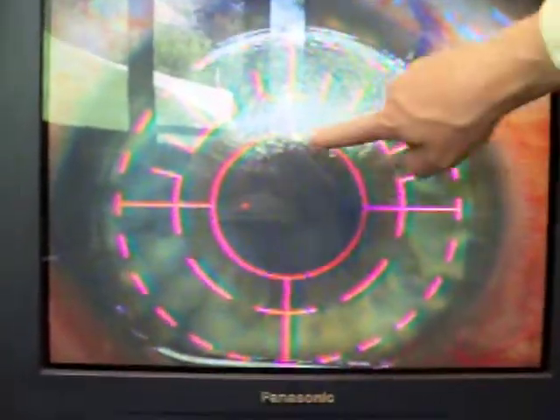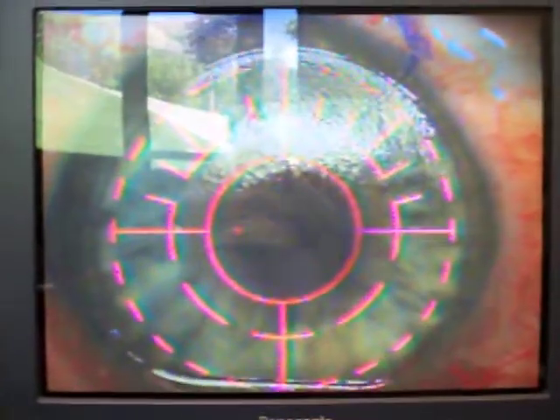Oh, wow. It's flattening out the cornea. You'll see as it gets across this edge here, and you see it's ablating that tissue and flattening that out as it goes. Wow. And now it goes in that random pattern because as it ablates the tissue, you see it moving around, those vapors actually come off and it can refract off those vapors. And so it goes in a pattern around those, lets the vapors come out of the way, and that's it. And that is the entire treatment right there. So he'll wash this out and irrigate it.